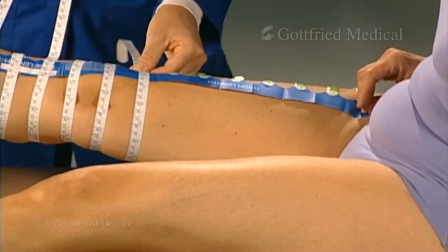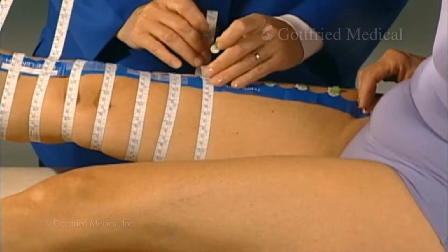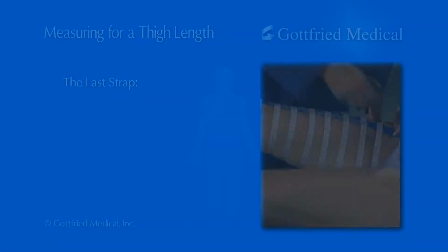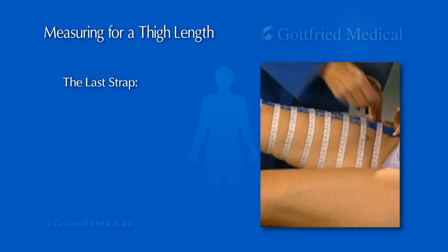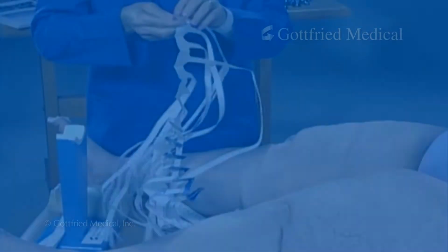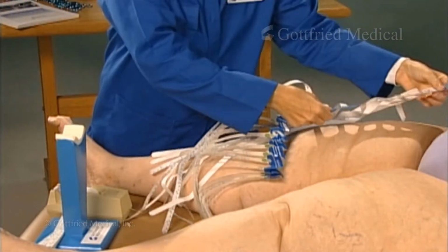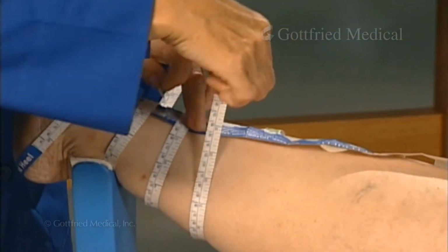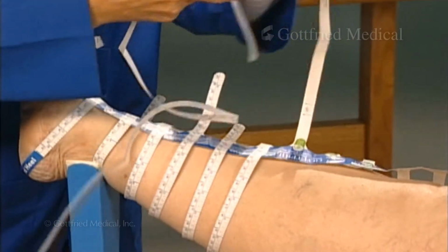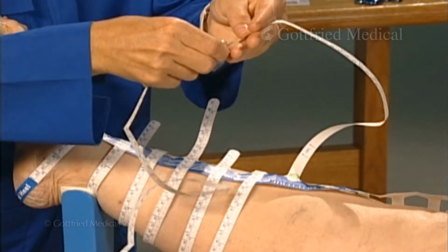If you are measuring for a thigh-length support, keep measuring up the thigh, wrapping the tapes in the same manner as the calf. The last strap should end within 2 inches of the groin. This helps prevent the support from sliding down the leg. If the patient or customer is heavy, gently pull the tape in until reaching a firm point. If the straps are too short to wrap completely around the leg, use a Gottfried Medical extension tape.